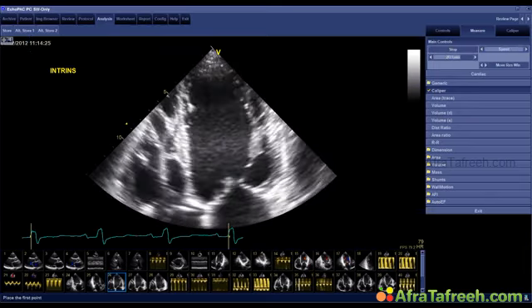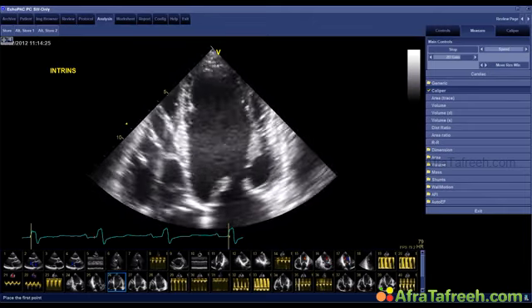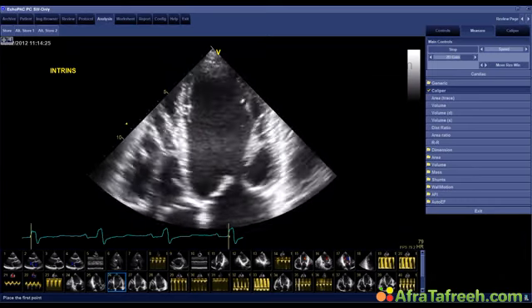You can nicely also appreciate that the mitral valve is not opening very much. Certainly not due to mitral stenosis, but probably more to the fact that he has myopathic opening, again, as a result of low flow across the aortic valve.